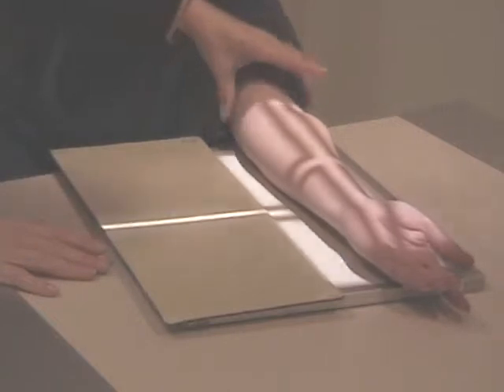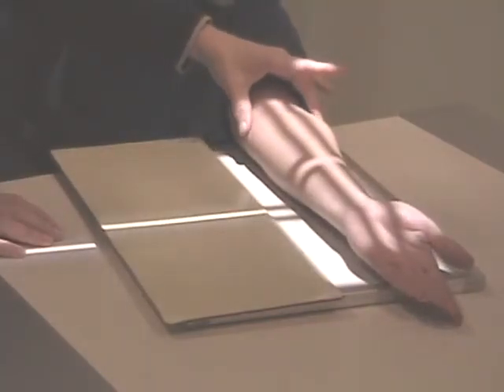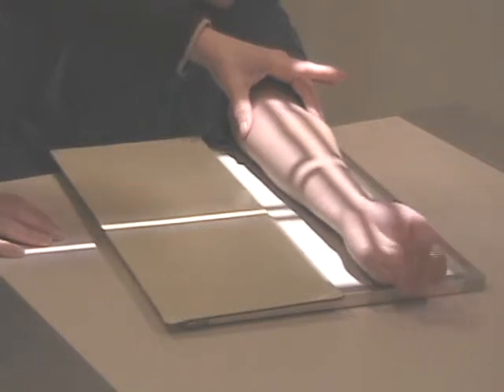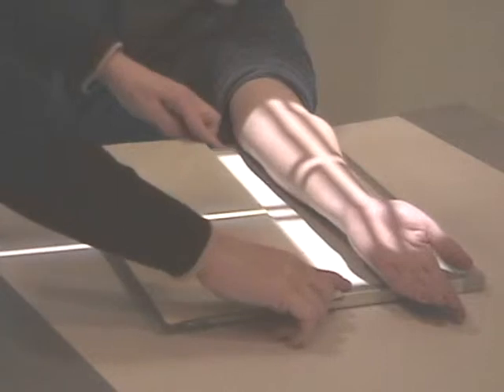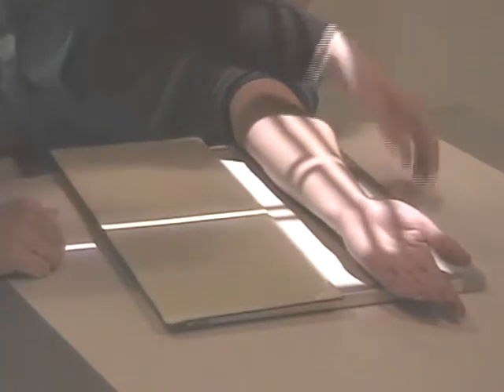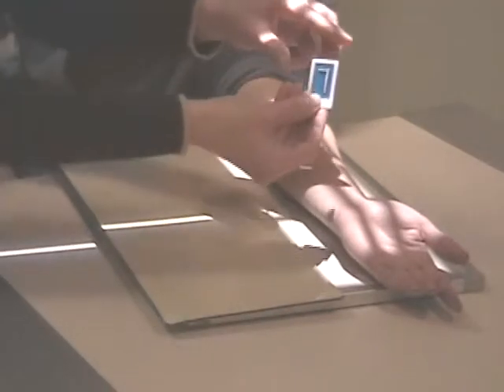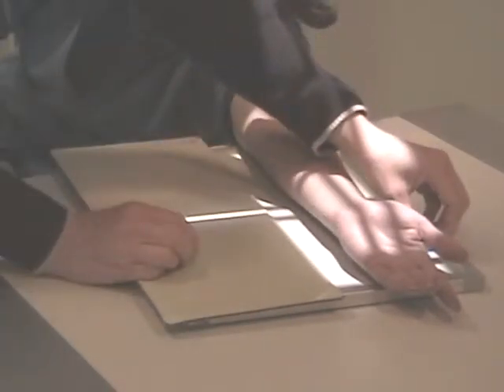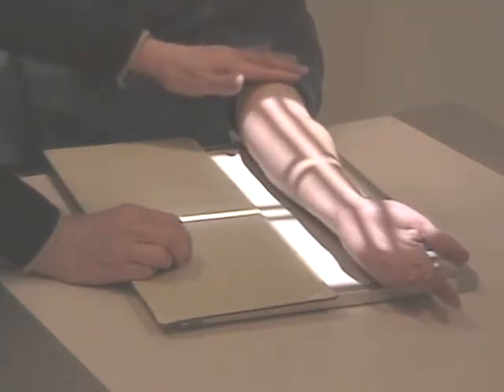Now I'm going to focus mostly on the elbow because it's proximal. I'm going to make sure the epicondyles are parallel. Equal light, a little bit of light, the crosshair coming down the shaft of the arm, and a left marker, fingers up, would go towards a corner here. Okay, and I can make the exposure and let her relax.